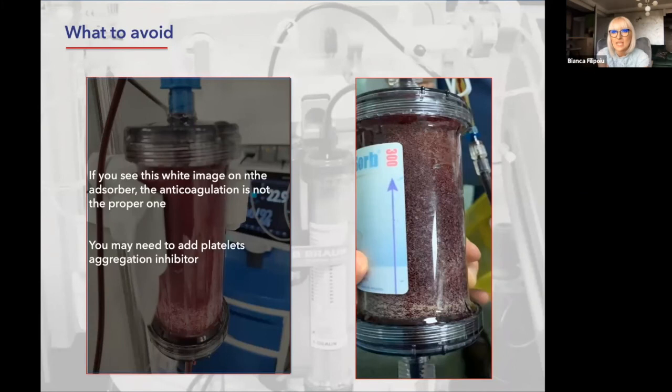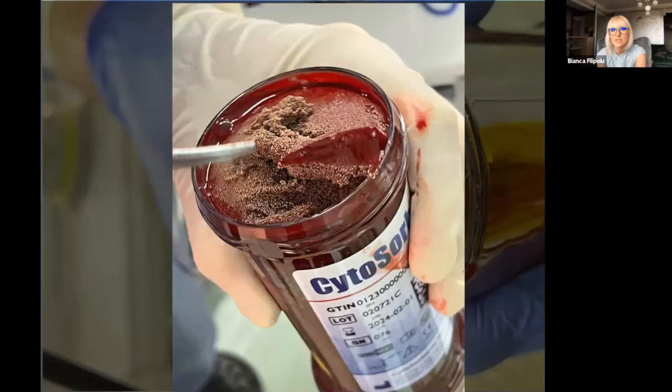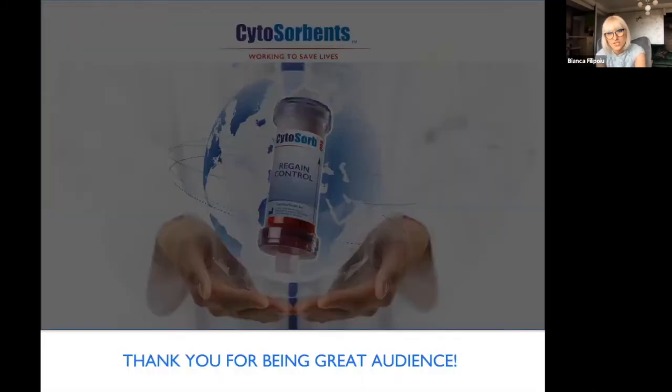In the beginning, there were some cases where they used citrate for anticoagulation of the extracorporeal circuits, heparin for systemic anticoagulation, and a platelet aggregation inhibitor, just to be sure that everything goes well. Otherwise, we can see clots like these, big ones, and inside of the adsorber, the same kind of clot. This is a COVID patient, and this happened after a few hours of treatment. So anticoagulation is crucial when we are talking about COVID patients. Thank you so much. That was from my side. Looking forward to hearing your questions.